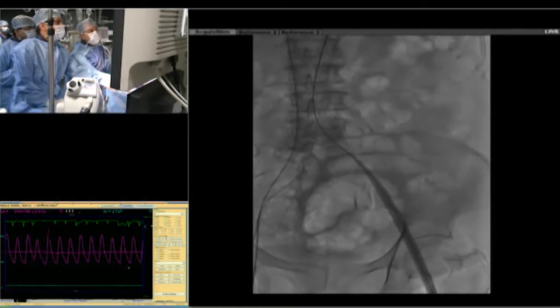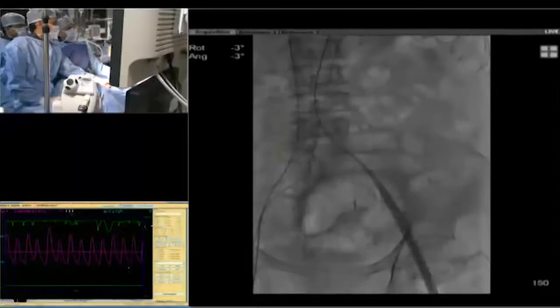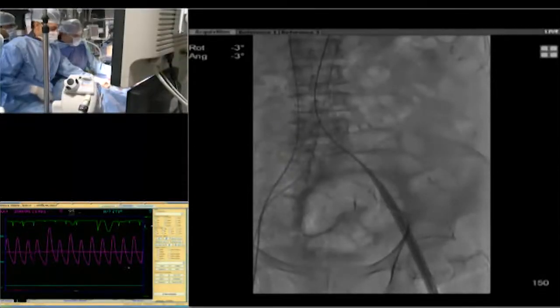Maybe some jiggle movement. It's already gone up to the iliac crest, you see. But do you think it's not going to go further? No, I'm not going to worry about it now. All right, sure. So we'll work from here.